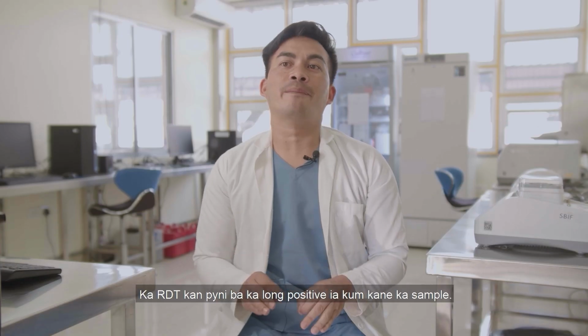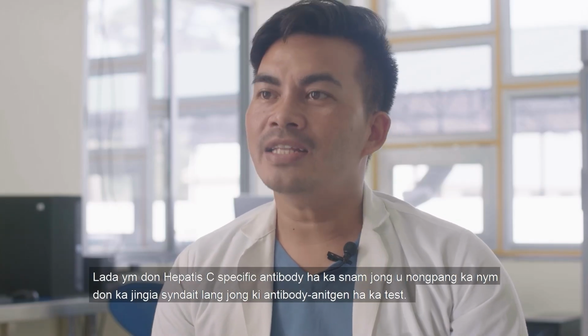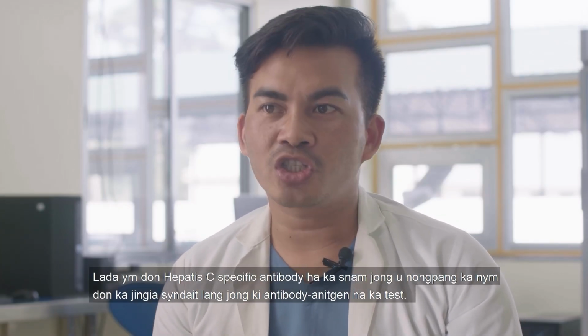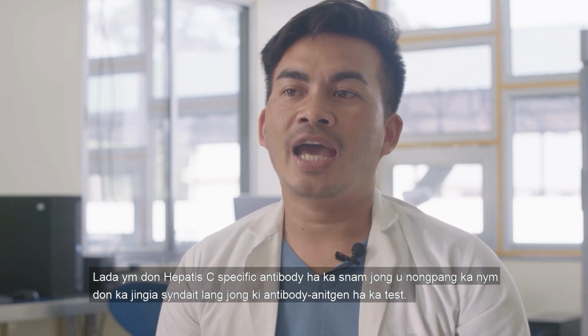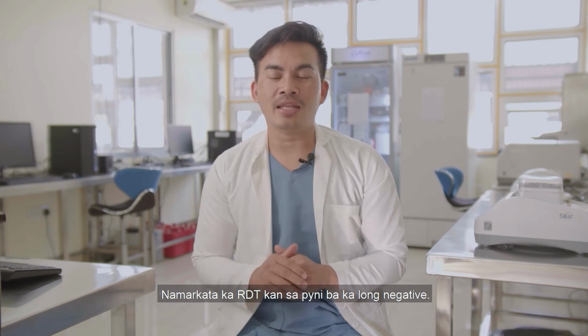The RDT will flag positive for such a sample. If there are no hepatitis C specific antibodies in the patient's blood, there will be no antigen-antibody reaction. Thus, the RDT will show no reaction and flag negative.